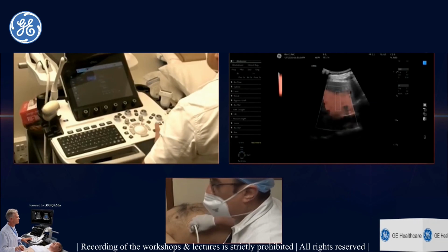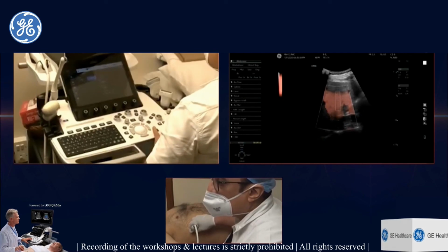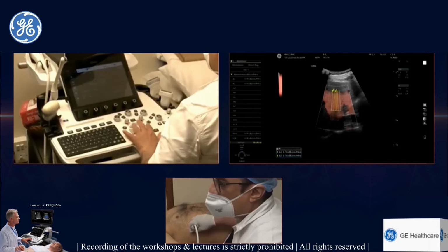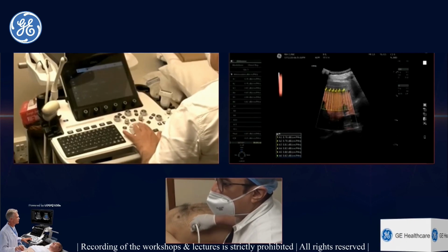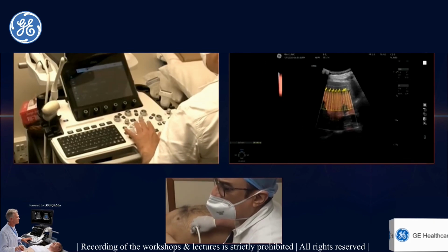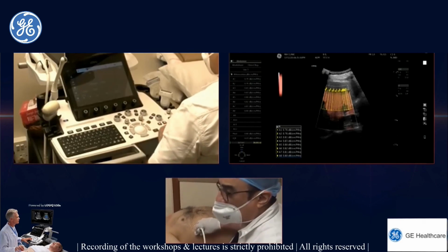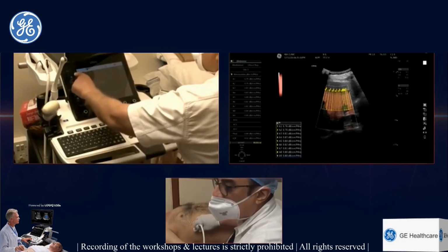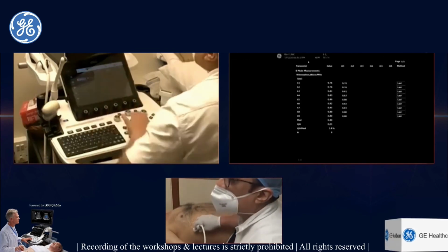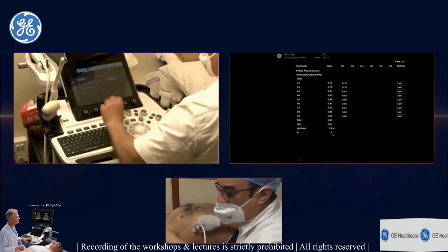So we have to tell you to stop breathing. Okay, just stop breathing. Okay, breathe normally, and we have finished with all our fat estimation. His fat estimation is quite high, 0.8. So this is above the stage of S3, and we have a median value of 0.80 with an IQR median of 1.6%. So not much statistical variation.